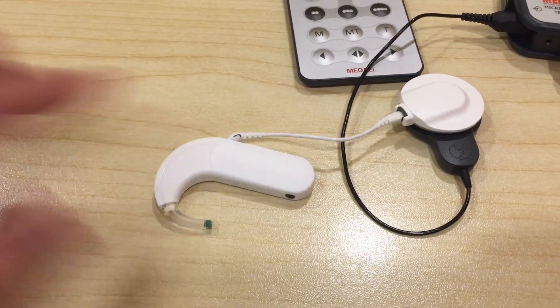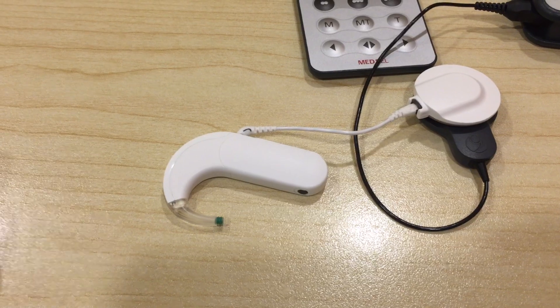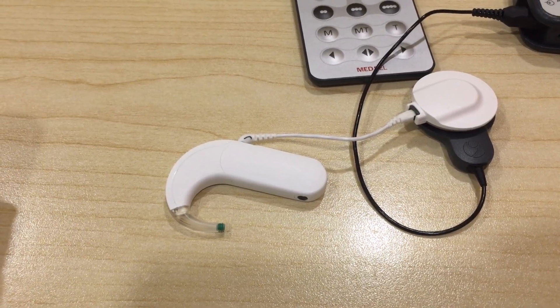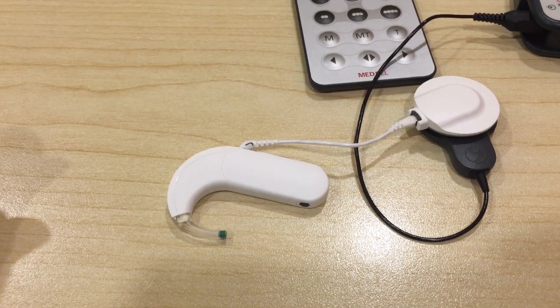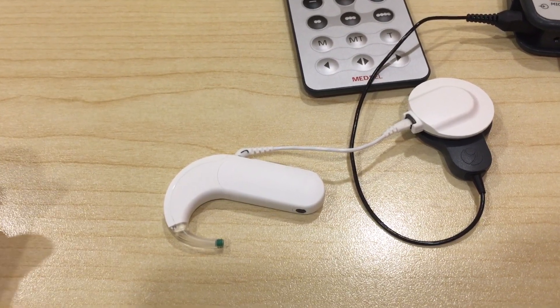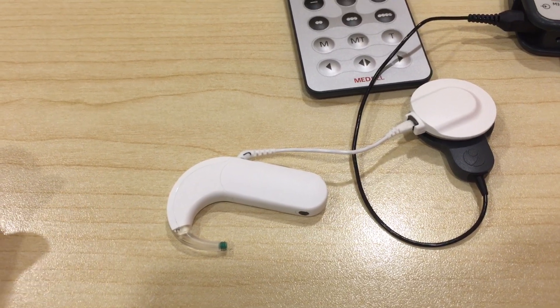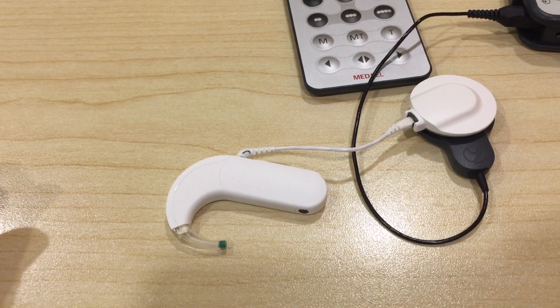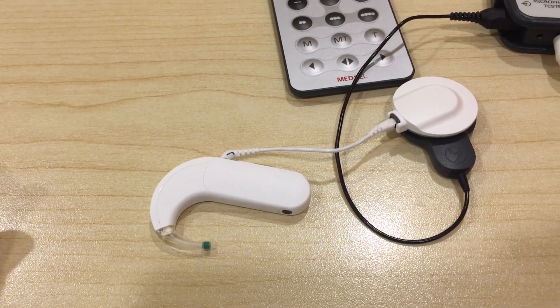One thing to take note of is that you have to use the standard battery cover. You can't use the FM extension sleeve or the built-in FM receiver on the battery sleeve. This is the only battery sleeve that will work to do a listening test.